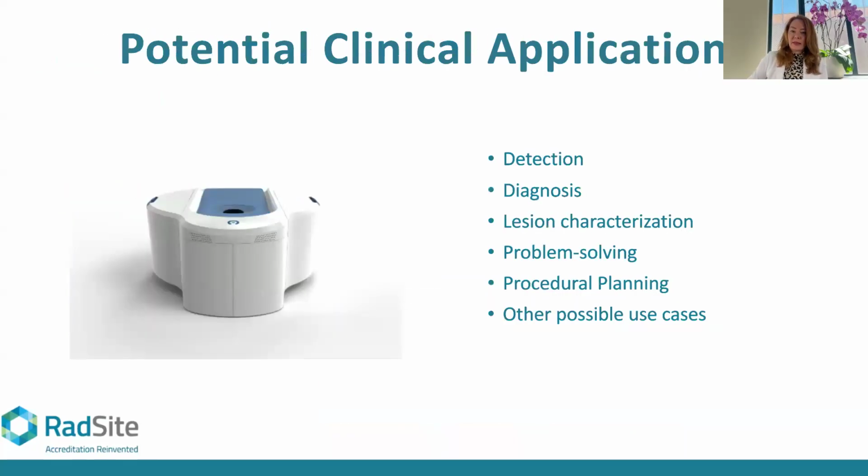So we did the double mastectomy, and the imaging had shown that her healthy breast that we had treated for cancer, we said, we don't see anything on that side. The final pathology showed that was accurate. There was no disease in her right breast. We had cured it. And on the left side, everything that we saw with abnormal blood flow, all of that was cancer. So the test was correct, the imaging was accurate, and that saved us from multiple steps, multiple processes.